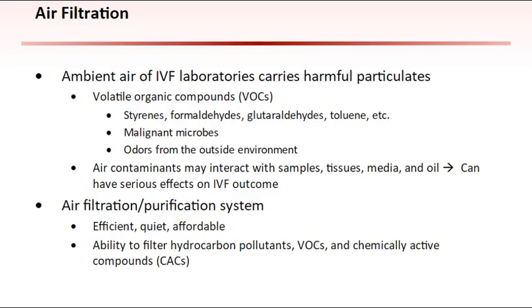Although particulate levels were negligible and met all specifications as a Class 100 CR, a slight increase in toluene was concomitant with a significant decrease in implantation rate. The subtle increase in toluene did not, however, affect fertilization rates or zygote and embryo morphology. These data suggest that control of VOC levels within the ambient air is critical for successful conception in vitro. This study is the first of several ongoing studies that may serve to broaden our understanding of the critical nature of the laboratory ambient air and the role it plays in pre-implantation toxicology.